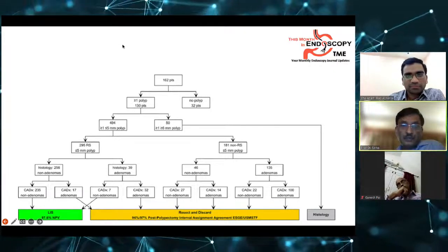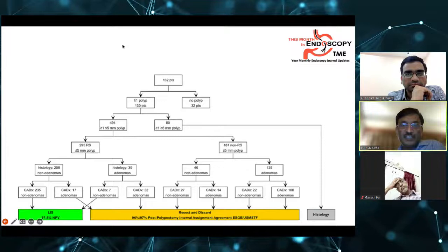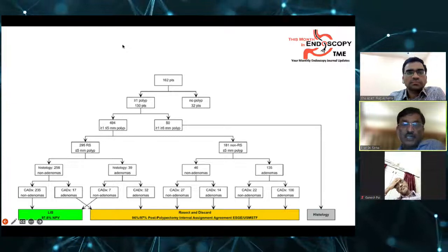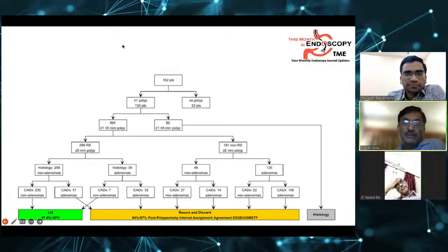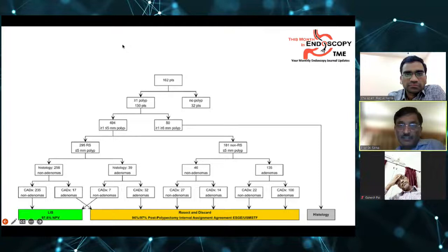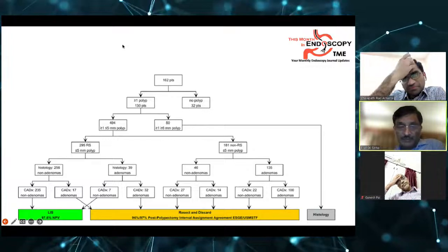So a little bit of compromise in video quality or disturbance, or a little bit of residue or surface coating, and the performance of the AI software decreases, and you cannot be very fast on that. So that takes a little bit of time. But given that, I actually disagree with 95% accuracy. For adenoma, the accuracy rate is possibly around 80%.